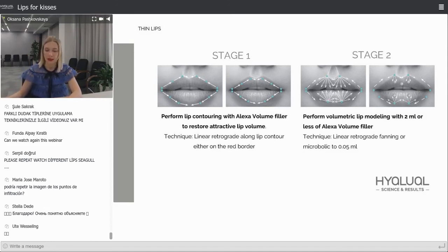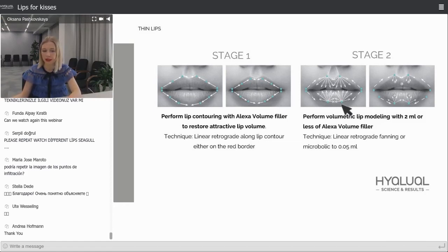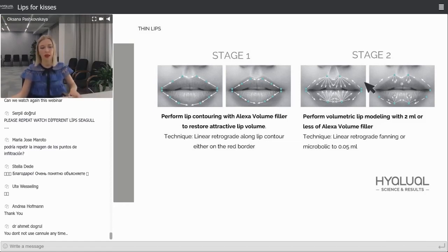And look at this photo. It's a very traumatic technique, so I try to avoid it, but sometimes it works. And also for this technique, use a thin needle, as for regeneration, 30 gauge would be excellent.